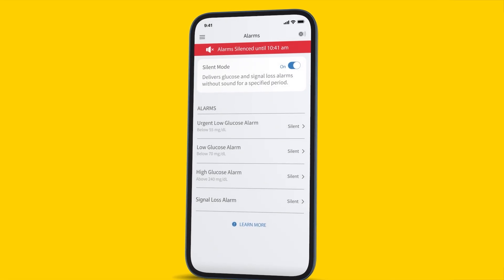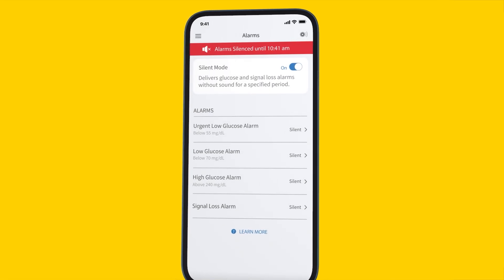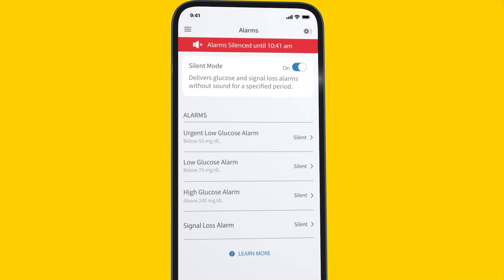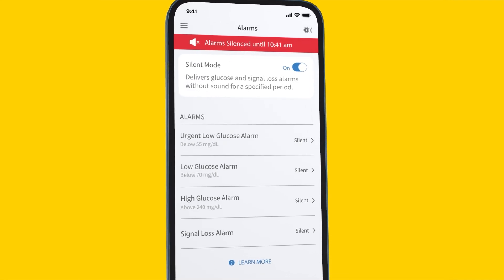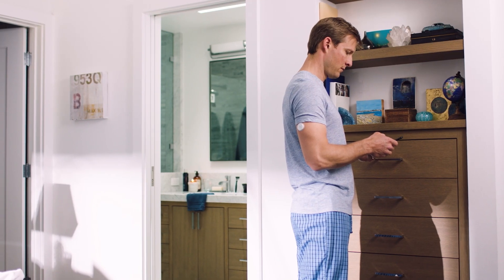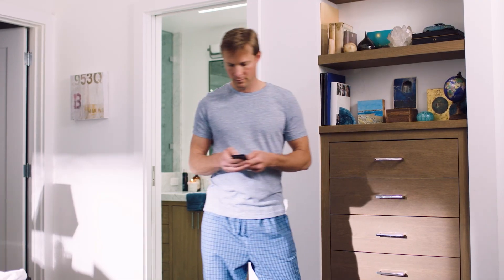You will receive a push notification reminder once half of the silent mode period has elapsed. You will not hear your glucose and signal loss alarms even if you have turned on override do not disturb, but you may still get the visual and vibratory notifications based on your phone settings.